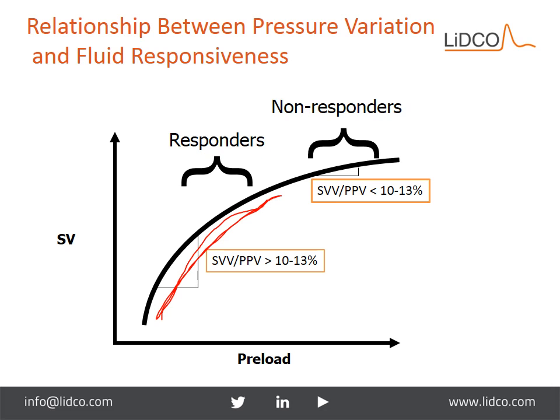How do we know with blood pressure and MAP and heart rate, and for those who are still holding on to CVP, and please be cautious when using a CVP because there are so many things that affect CVP that have nothing to do with volume. For a quick example, right-sided heart failure. How do you know when you're giving fluid or titrating or in the throes of resuscitation when you are right here? How do you know when, if you continue giving that fluid, that your patient will no longer respond?